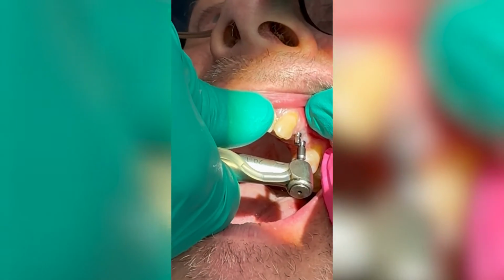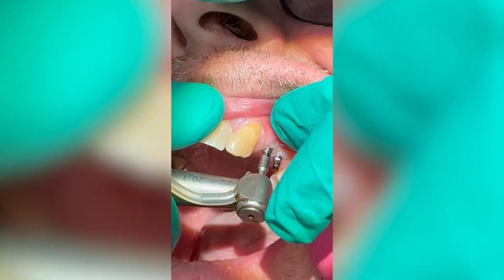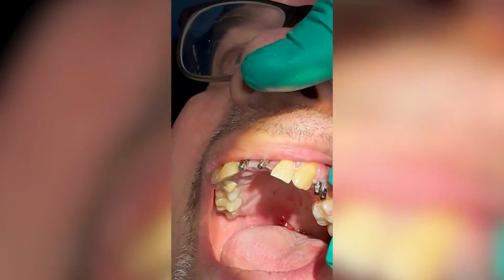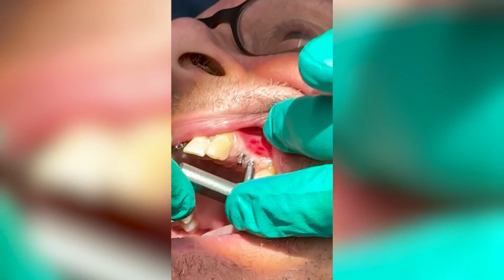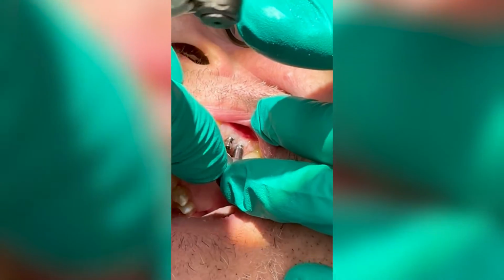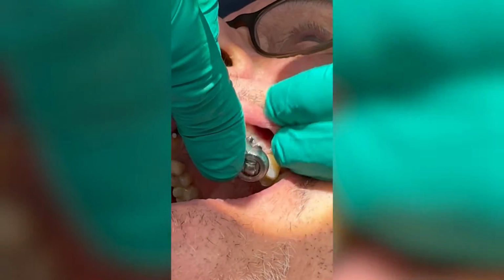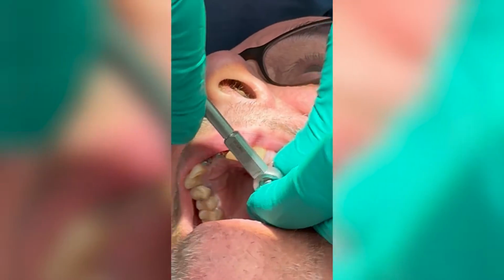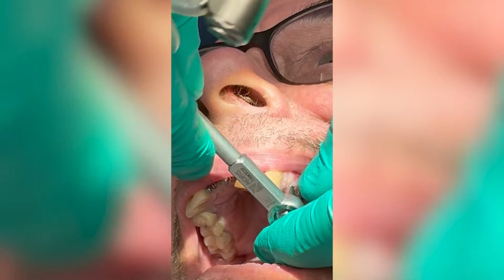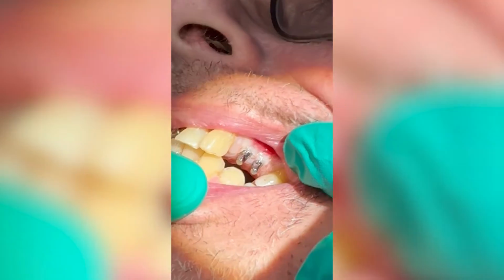We're going to go ahead and... We still got 30 Newton centimeters of torque. Turn toward me just a little bit. Okay. So we're going to just do a little bit of adjustment here on the angle. And then again on this one. Okay. Bite together. We're good. Perfect.